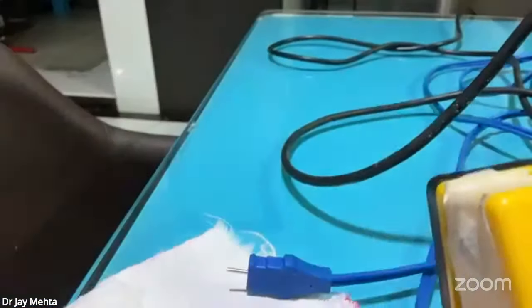So in these situations where there is one bipolar separate pedal, the foot switch, and the cutting and then coag, how different do you think these work? I mean, is it really required? It's up to the manufacturer, madam. Many manufacturers will give you 3 pedals, one for seal, one for coag, and one for monopolar, one for bipolar. It's fine. Yeah. It's just the way it is. If you have a foot pedal like this, see, this is a foot pedal which has incorporated the bipolar mode as well as seal mode.